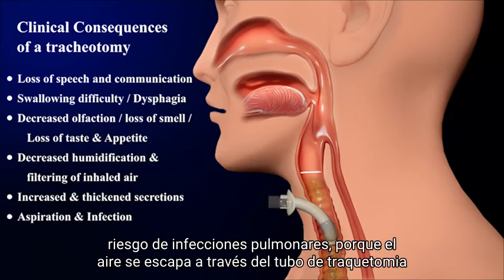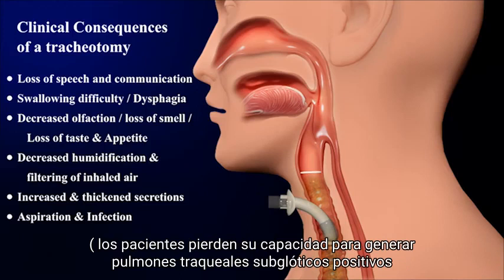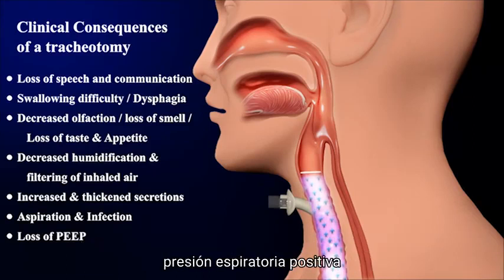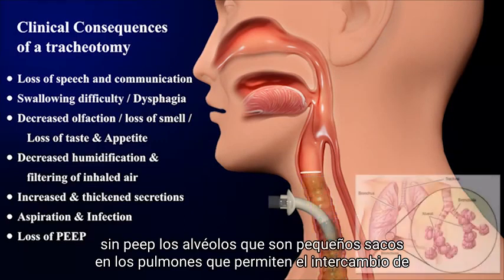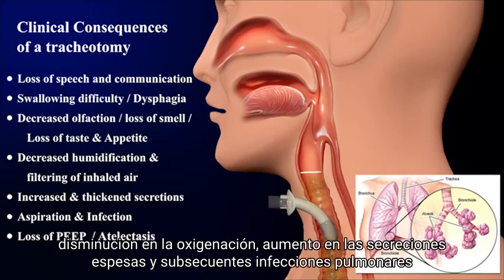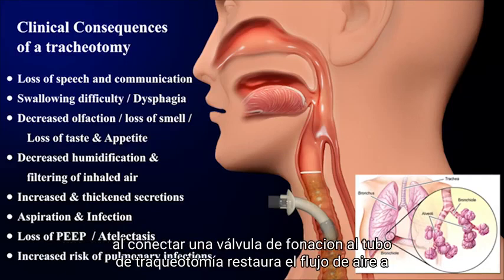Because air escapes through the tracheotomy tube, patients lose their ability to generate positive subglottic tracheopulmonary airway pressure, so that they are unable to generate physiologic PEEP, or positive end expiratory pressure. Without PEEP, the alveoli, which are tiny sacs in the lungs that allow exchange of oxygen and carbon dioxide, can collapse. This causes atelectasis, decreased oxygenation, increased and thickened secretions, and subsequent pulmonary infections.